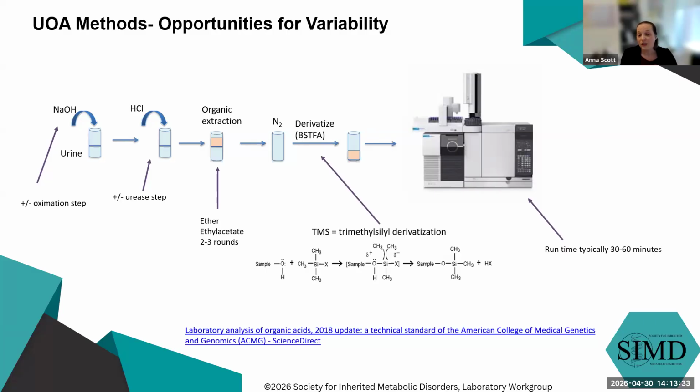Without oximation, could we have seen the succinylacetone in that previous example? I'm not sure about the first sample that was very short. I would hope we would have seen it in the second sample where we had more volume. Hard to know for sure. But plus or minus oximation is a significant difference between different lab procedures.